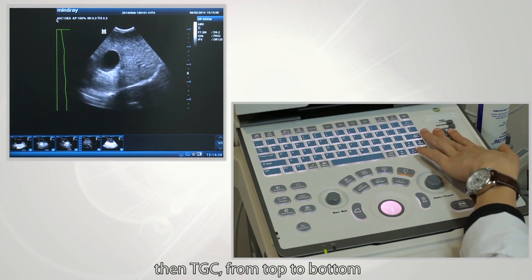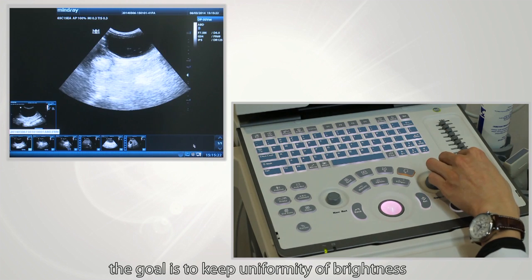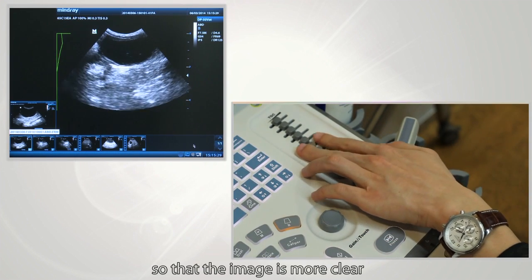Then adjust TGC from top to bottom. The goal is to keep uniformity of brightness. Below a fluid echo area, you should adjust TGC to a relatively lower level so that the image is more clear.